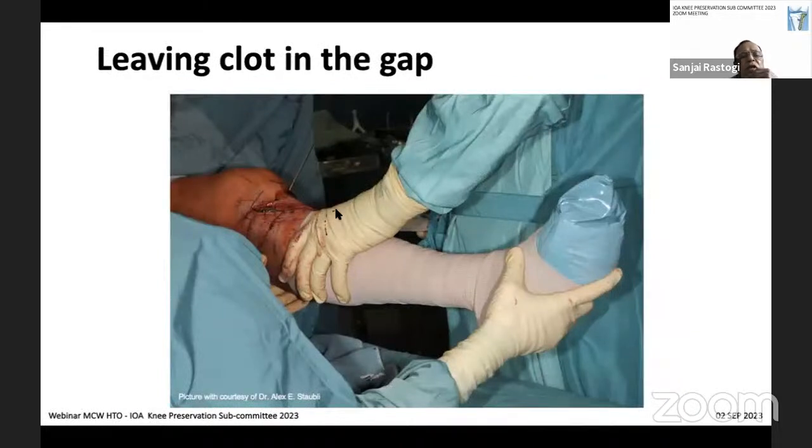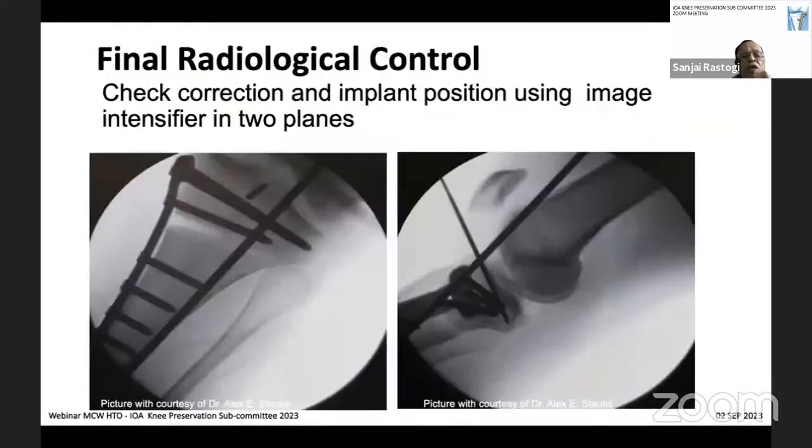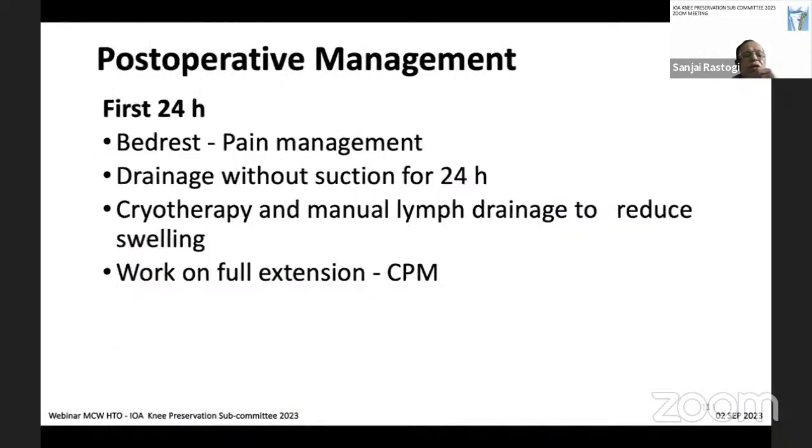The osteotomy hematoma is retained by applying a compression bandage for 8 minutes. This time is utilized to check the correction, and then the wound is closed with an overflow drain.